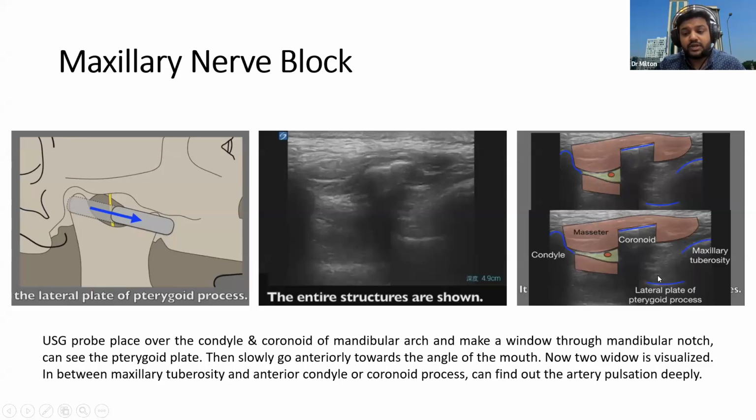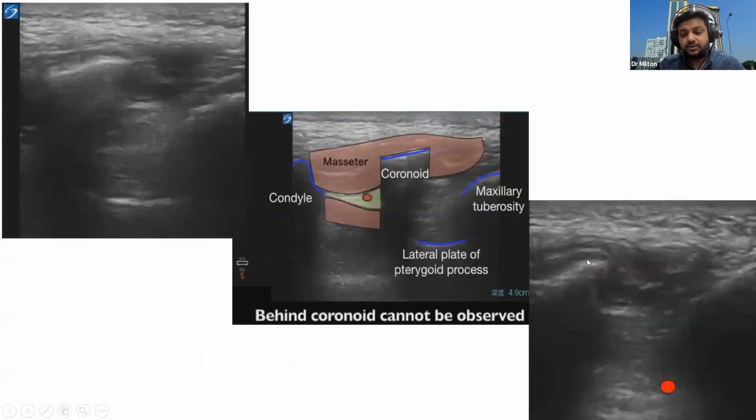Here we can see arterial pulsation, a very important deep part, not superficial. You can see the deep blood flow here on Doppler.